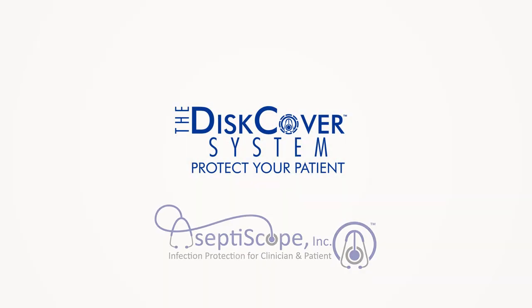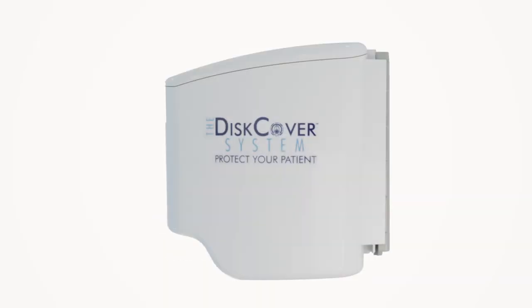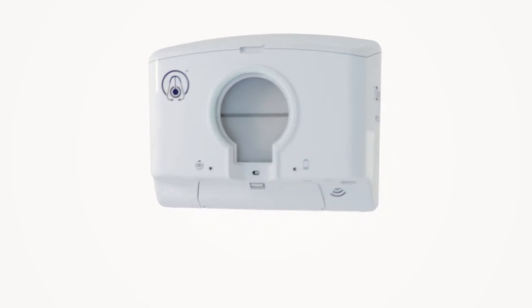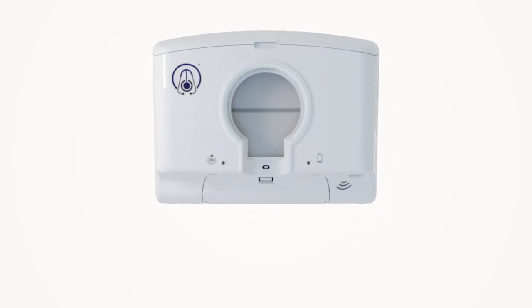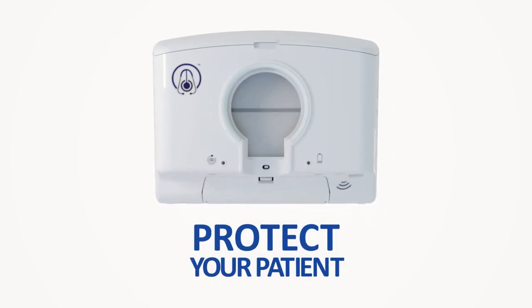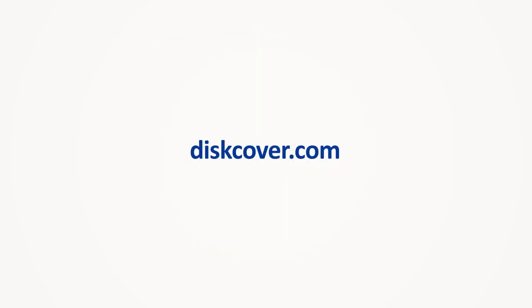The DiskCover system from AseptiScope, the world's first touch-free stethoscope barrier dispensing system. Protect your patient. For more information, visit diskcover.com today.